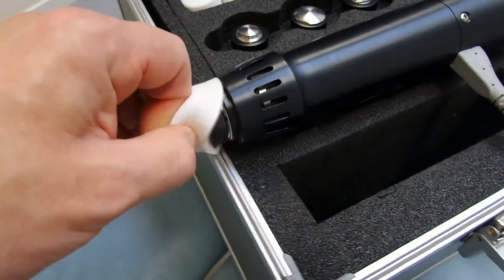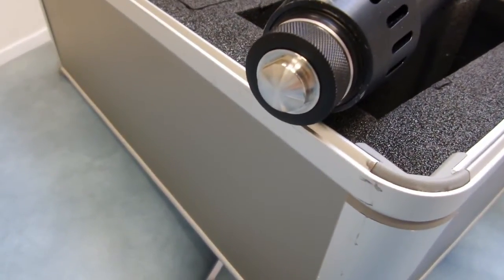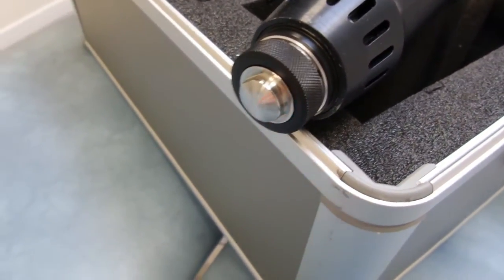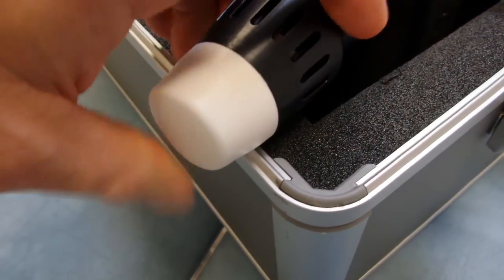Today we're going to be doing shockwave to the foot. As you can see here we're using the 15mm shockwave head. Putting the rubber coating back on helps to protect the head and keep the heat off the foot.